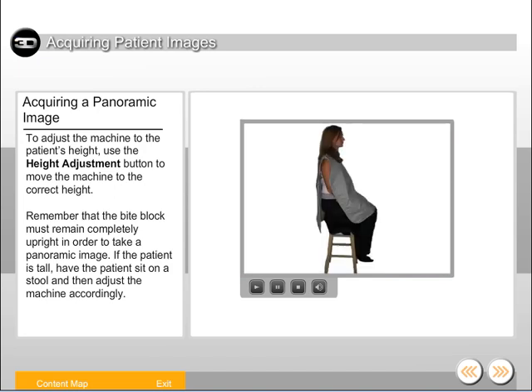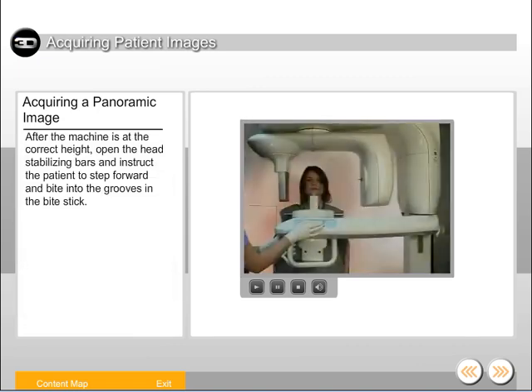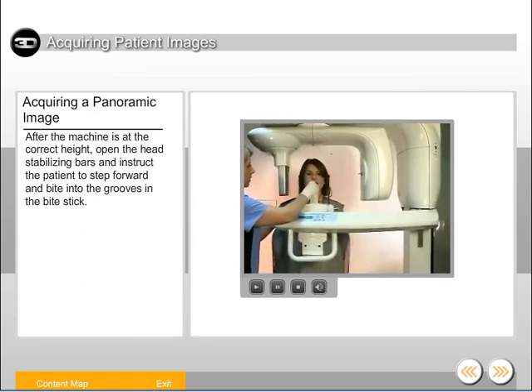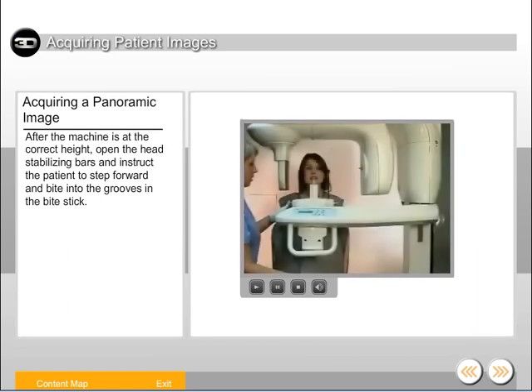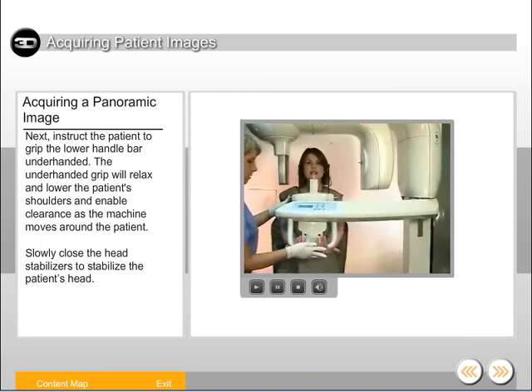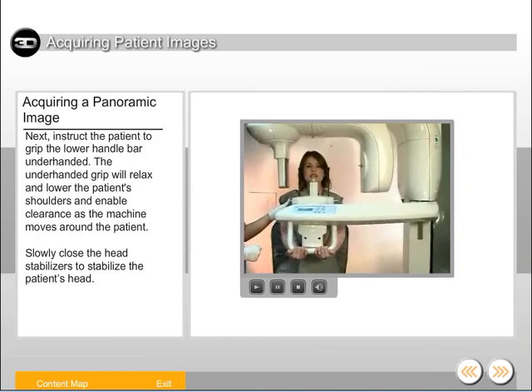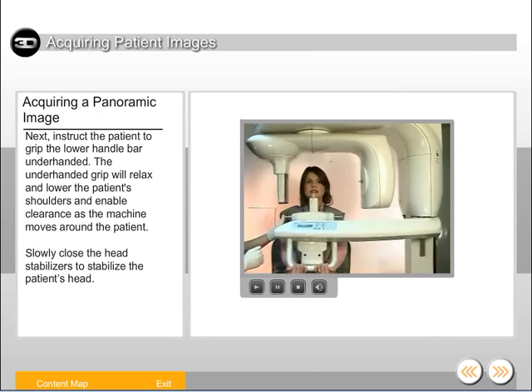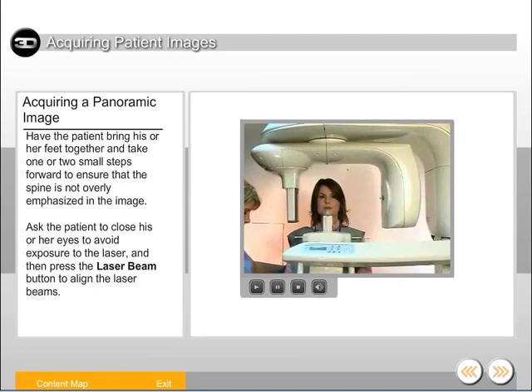If the patient is tall, have the patient sit on a stool and then adjust the machine accordingly. After the machine is at the correct height, open the head stabilizing bars and instruct the patient to step forward and bite into the grooves in the bite stick. Instruct the patient to grip the lower handlebar underhanded. The underhanded grip will relax and lower the patient's shoulders and enable clearance as the machine moves around the patient. Slowly close the head stabilizers to stabilize the patient's head. Have the patient bring his or her feet together and take one or two small steps forward to ensure that the spine is not overly emphasized in the image.